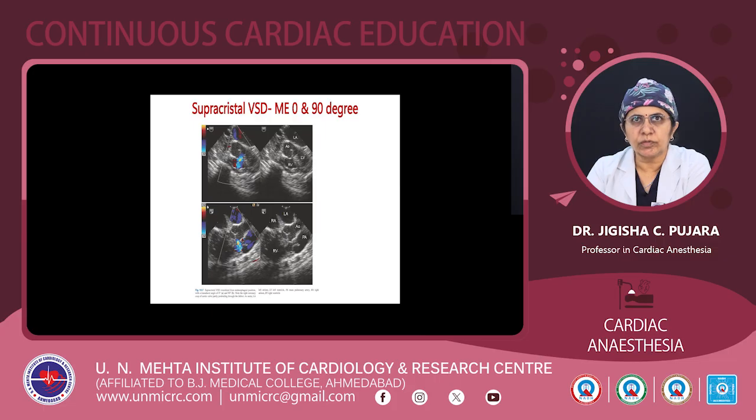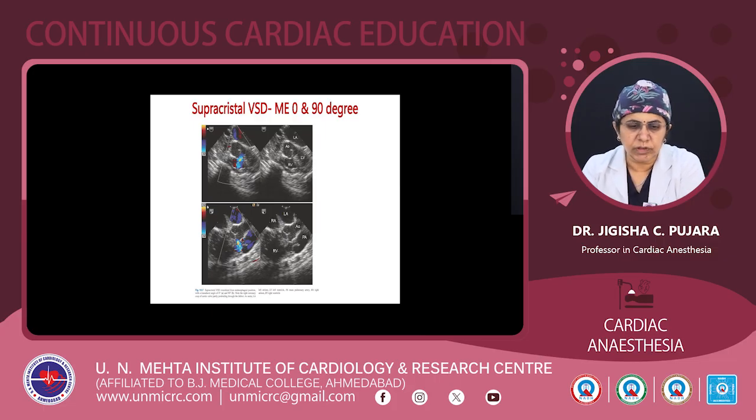Supracristal VSD, mid-esophageal 0 and 90 degree views. Here in the first image you can see a VSD flow at the 0 degree angle, and the second is the outlet. This is the outlet VSD, the supracristal VSD. In image B, it is a long axis view at around 90 to 100 degrees. You can see the outlet VSD, the supracristal VSD, and you can do color flow and spectral interrogation of the VSD in this view.